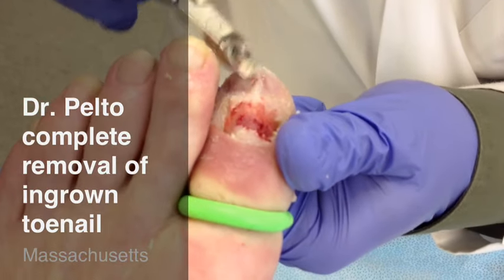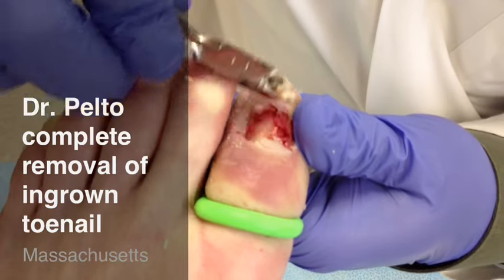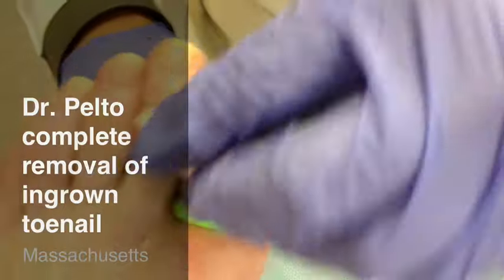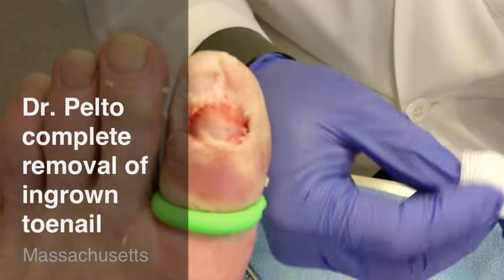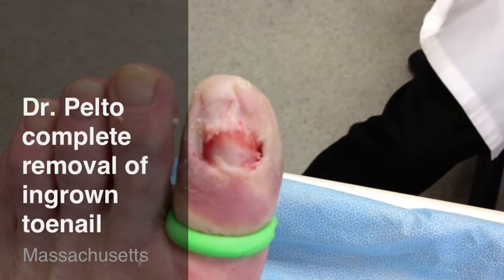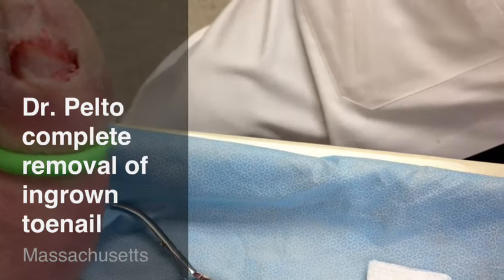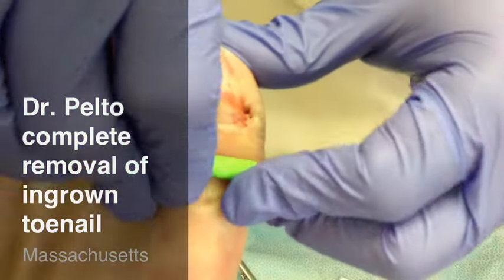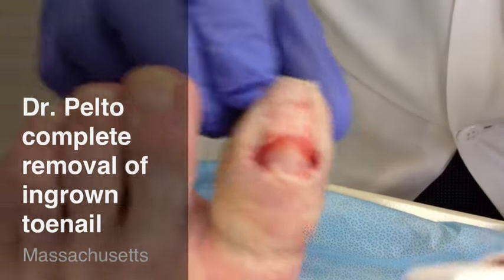And that's how we remove a nail. Now I'll show you how to do the dressing. This is a dressing that we do for every type of nail procedure — it's pretty much the same, it's standard. We take a little iodine, or betadine as we call it, and put a little bit of the iodine on the gauze. Then take off the tourniquet — you'll see how the blood flow will return quite quickly to the area.